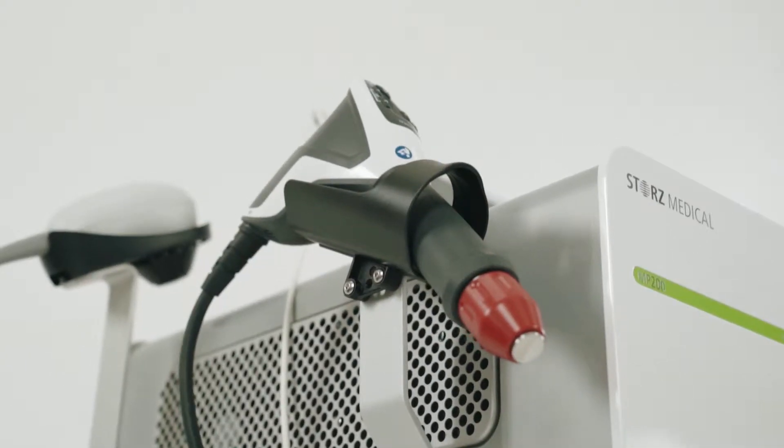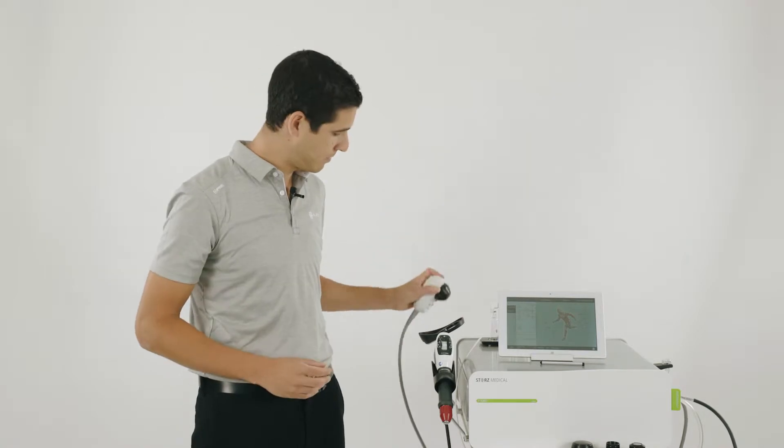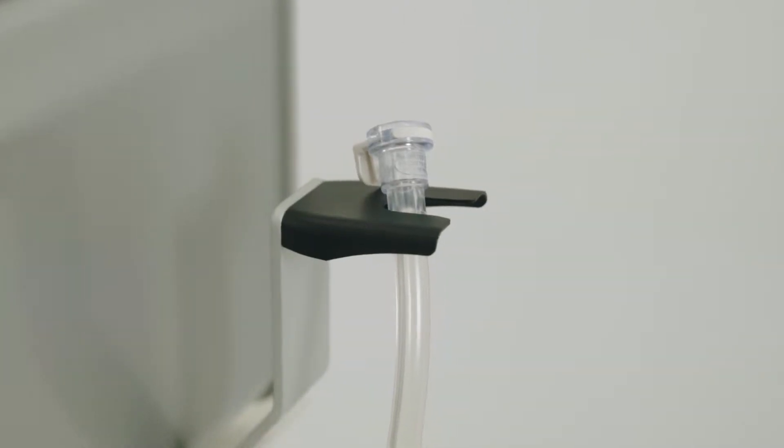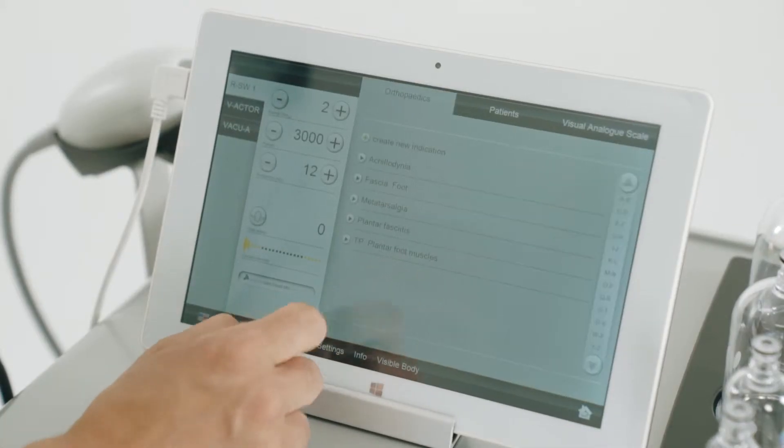The MP200 comes with the radial shockwave handpiece, the V-actor, and the vacu actor which is used for cupping. On the tablet, you can select which modality you wish to use.